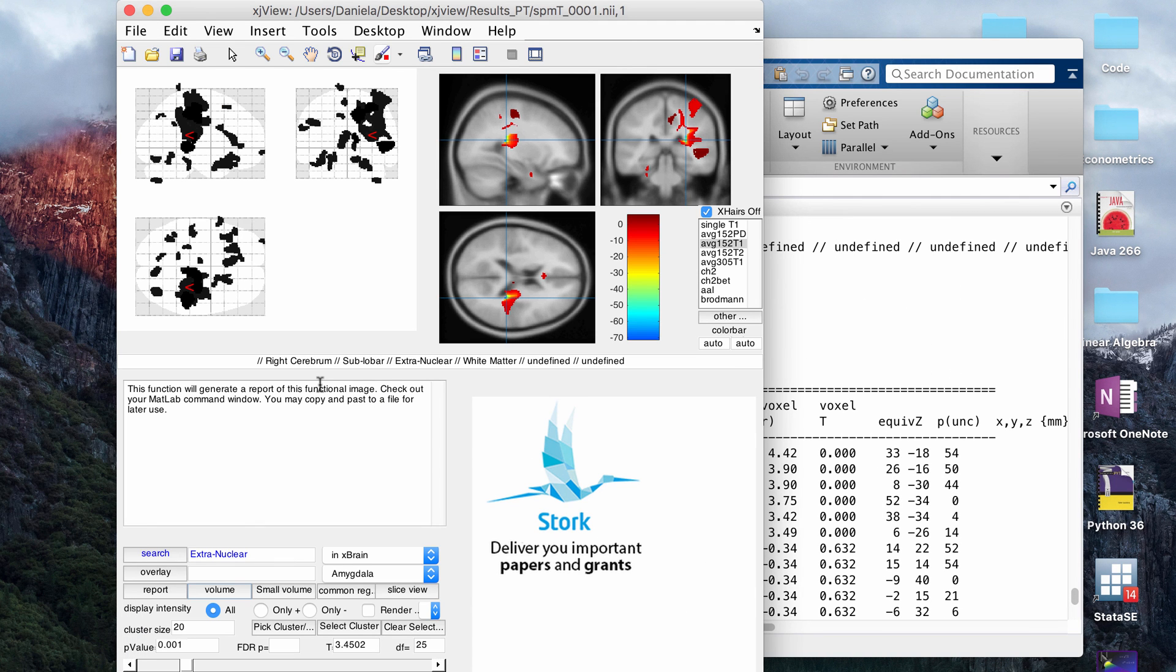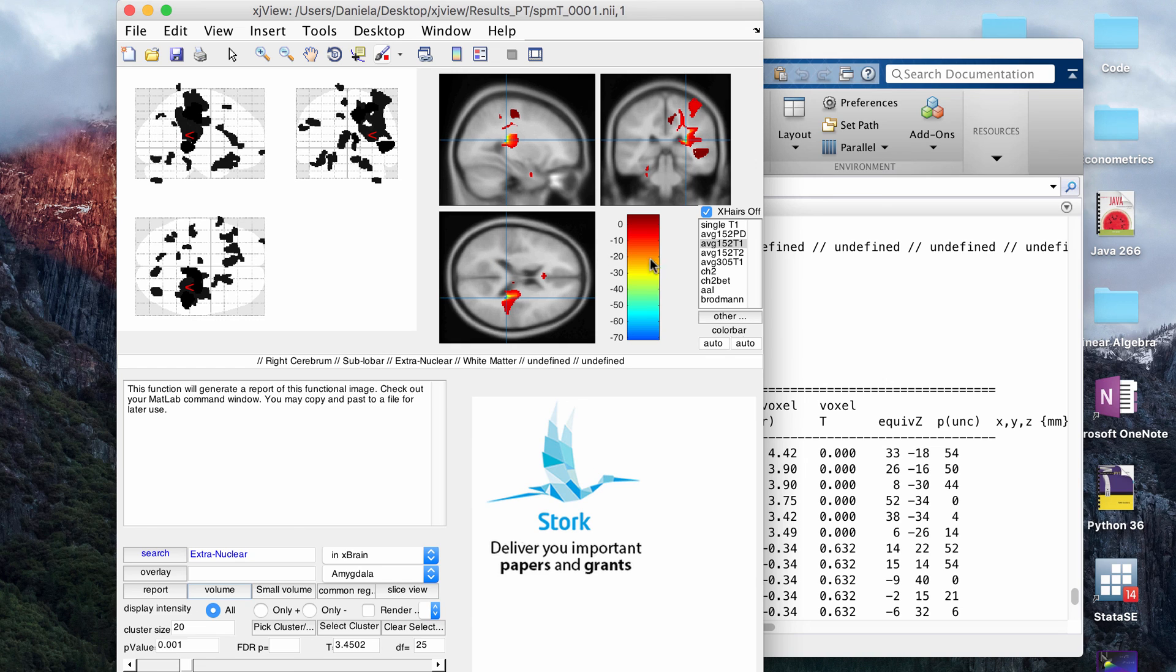Alright, so that's pretty much all I wanted to talk about in this video. I think XJ view is really helpful for VBM analysis, so I use it a lot, and it definitely can give you some more information than just the regular SPM GUI.